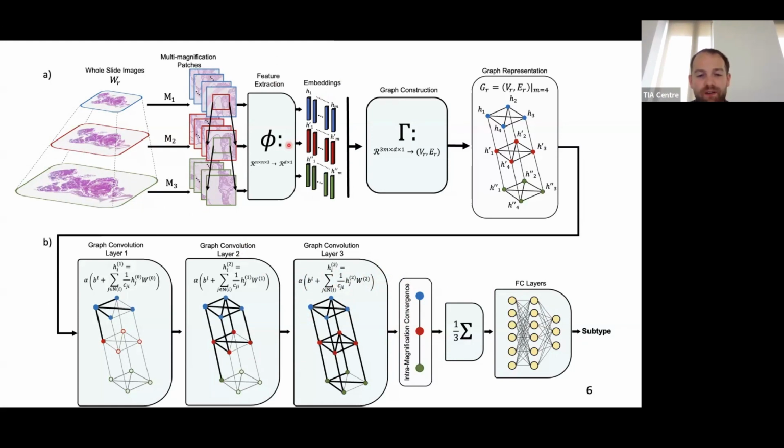So what would you say, from your experience of this work, are the next steps for the field of computational pathology, particularly in terms of relating this sort of model to, say, foundation models? So yes, the thing that we realized with this work is basically that your encoder matters.